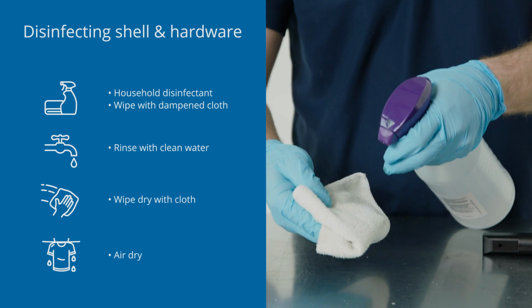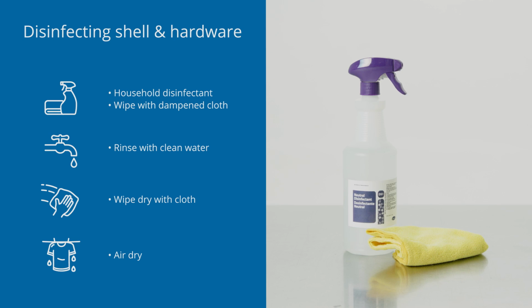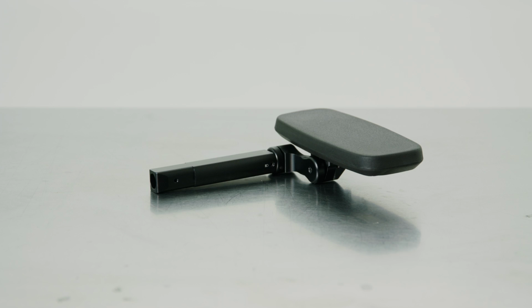To disinfect the hardware after cleaning, wipe gently with a cloth dampened with household disinfectant. Rinse with clean warm water and wipe dry with a clean cloth and then allow to air dry completely.